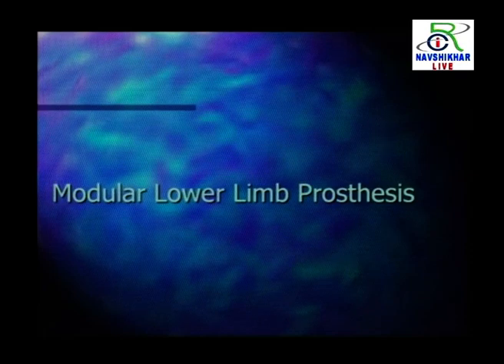The concept of modular prosthesis actually came first in lower limb prosthetics, and is more relevant there, because even though we are fabricating an integrated system for upper extremity prosthesis, the interchangeability of terminal devices was already there. Only after the socket, the pylon and elbow joint, these two types of modules are now available. There are not too many changes in upper extremity prosthetics, but in lower extremity prosthetics the concept of modules is more relevant. So now we are going to discuss the modular concept in lower limb prosthetics.